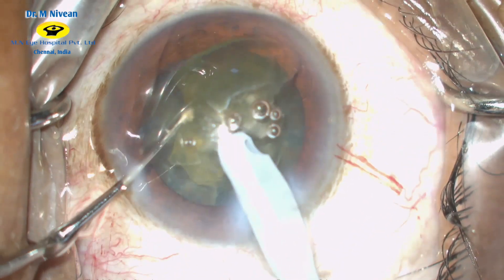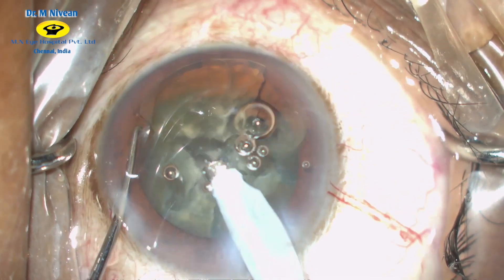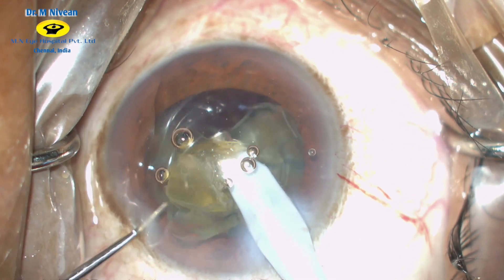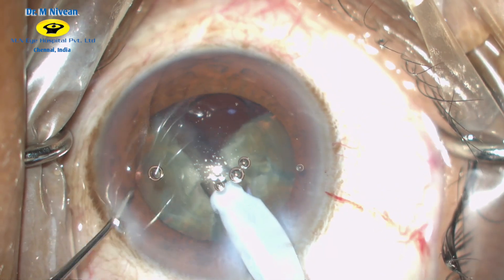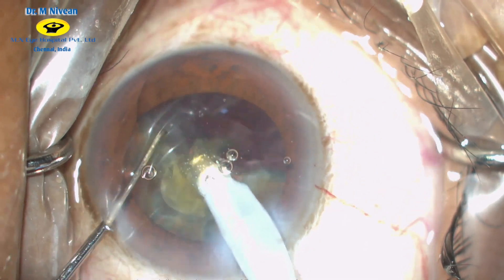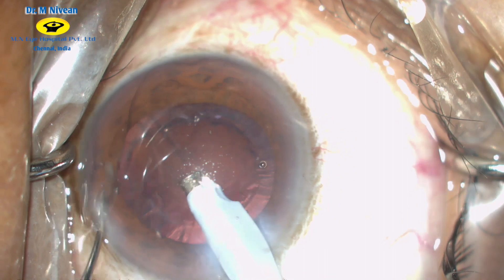Mechanical separation is then done to confirm the split of the nuclear plane. Emulsification of the nuclear fragments is done by bringing each nuclear piece up to the pupillary plane and emulsifying them in a controlled fashion. You can observe a well-formed anterior chamber and good followability of the fragments. Since we are using the linear foot pedal, we do not have to worry about the last piece as the vacuum is under foot control.